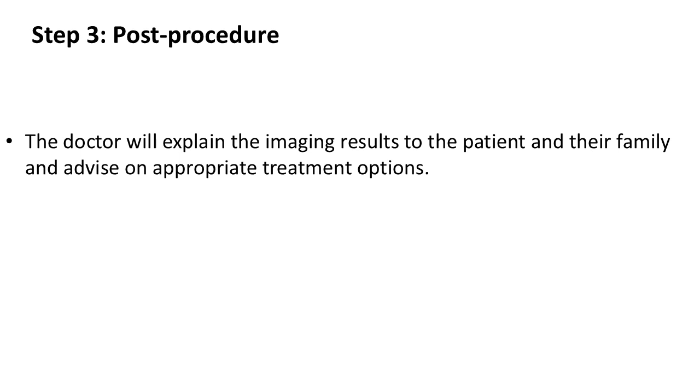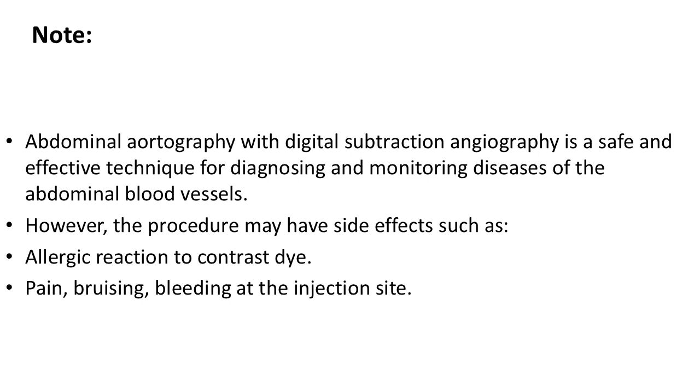The doctor will explain the imaging results to the patient and their family and advise on appropriate treatment options. Note: abdominal aortography with digital subtraction angiography is a safe and effective technique for diagnosing and monitoring diseases of the abdominal blood vessels.